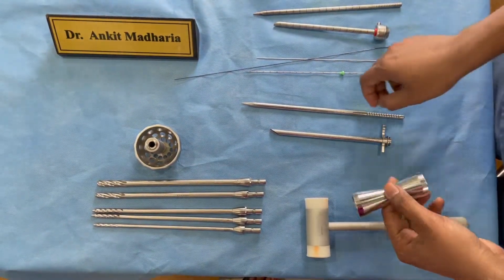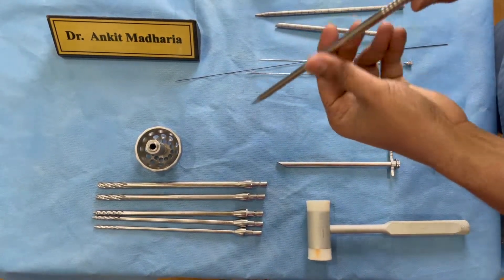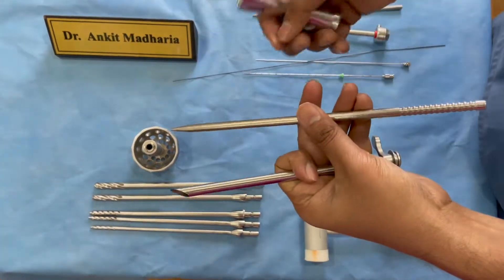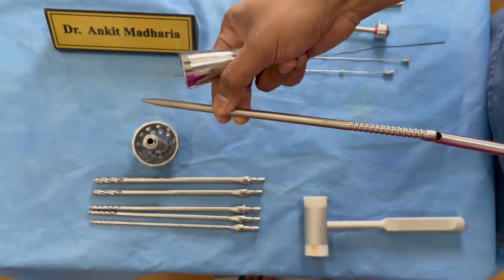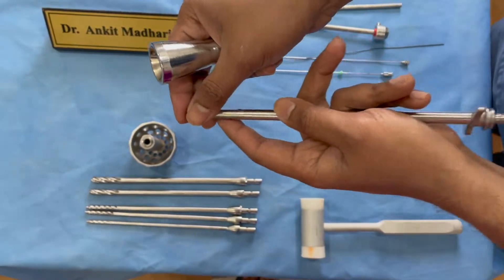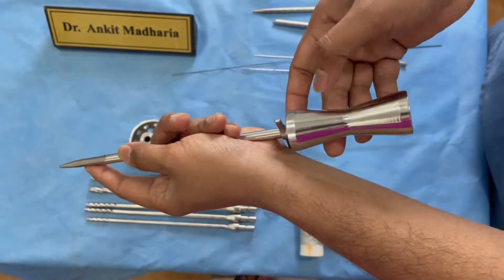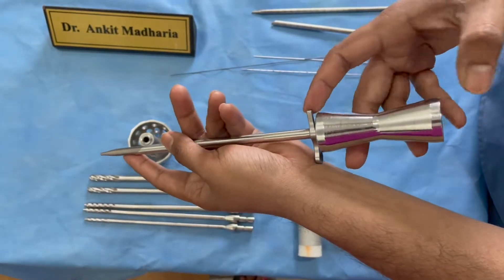The next thing you need is a tapper, because once you have put in your dilator and the cannula over it, you need to push the cannula inside. This tapper fits right over here and you can hammer it from over here.